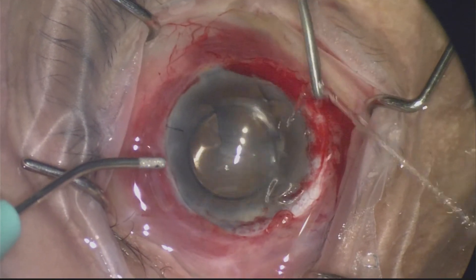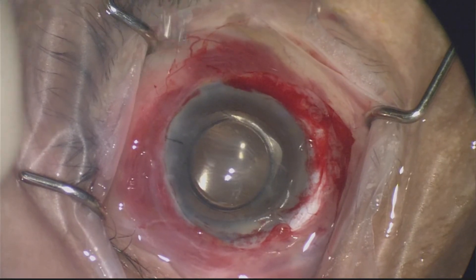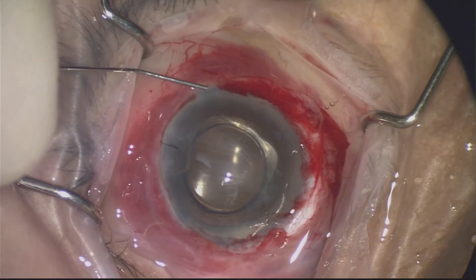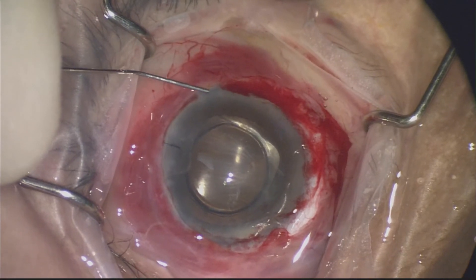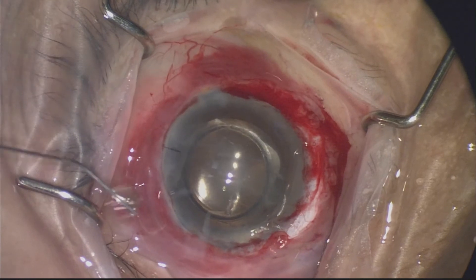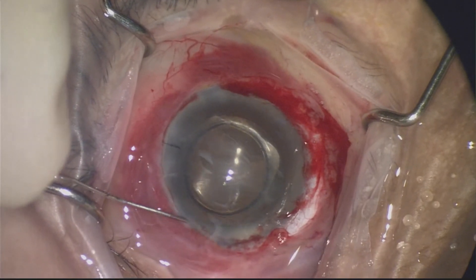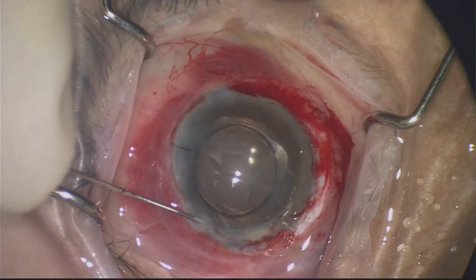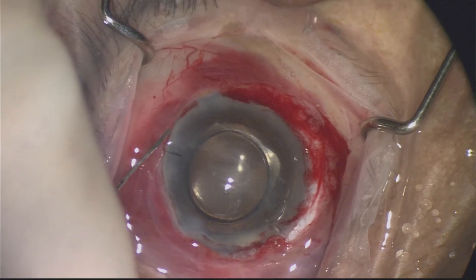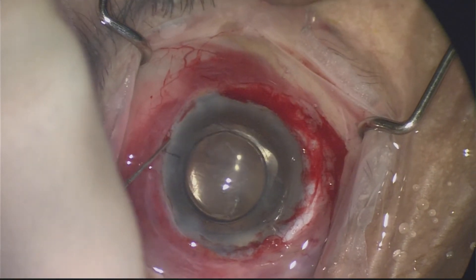Here I'm checking with irrigation and taking the aspiration out to see if the wounds are secure. I'm doing very gentle stromal hydration — especially in these diseased corneas, you don't want to over-stromally hydrate, particularly when you've already put a suture in. If the AC is still collapsing, it may not be a bad idea to suture the paracenteses as well.